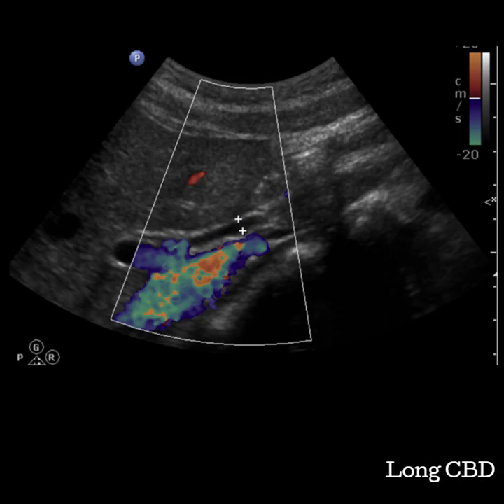You can take the duct images with your patient either in the supine or rolled position. The rolled position may actually provide a better window to the common bile duct as the duodenum will change positions. Another way to identify the common bile duct is to visualize the pancreas head. Looking for the two circles at the head, remember that the more anterior one is the gastroduodenal artery and the more posterior one should be where the common bile duct pierces the pancreas head. This will help to ensure that you are outside of the liver.